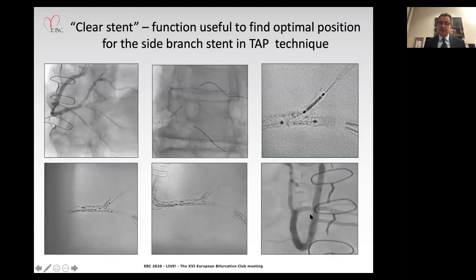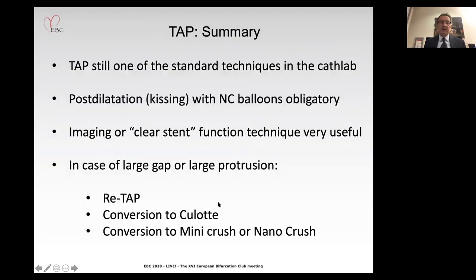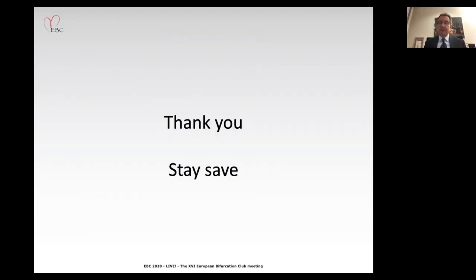As you can see, you can achieve quite an acceptable result using this function. In summary: TAP is still a standard technique. Post-dilatation and kissing balloons are definitely obligatory. Imaging — IVUS, or especially OCT, or the clear stent function — is very useful. In case of large gap or large protrusion, use a redo TAP as one option. The second option is conversion to Culotte, mini-crush, or nano-crush. Thank you and stay safe.